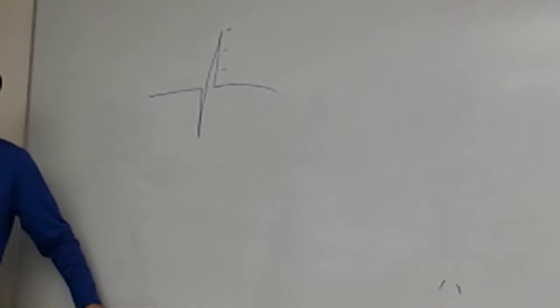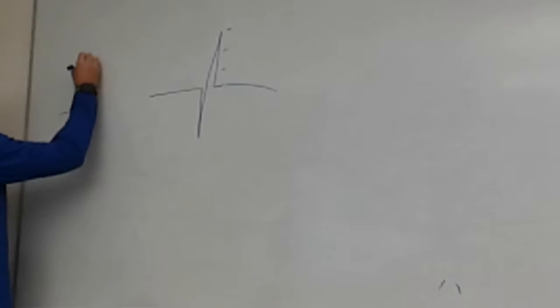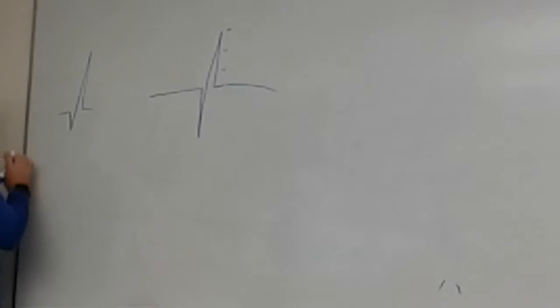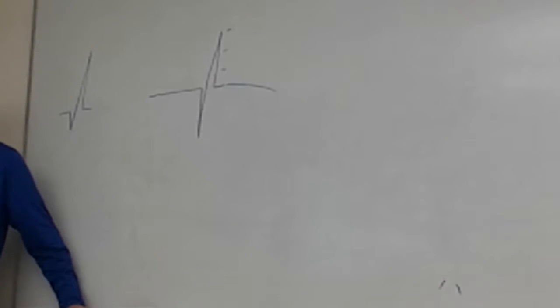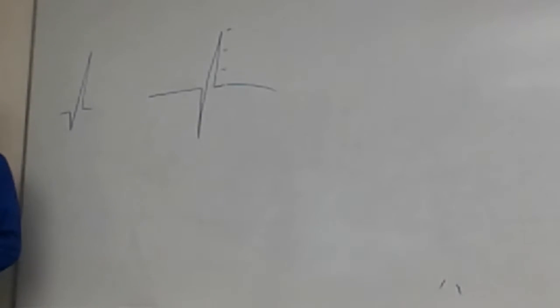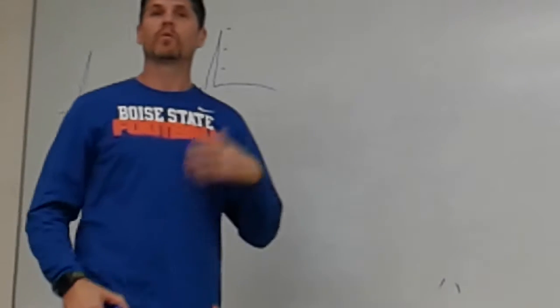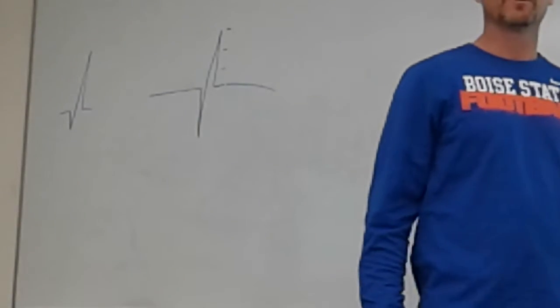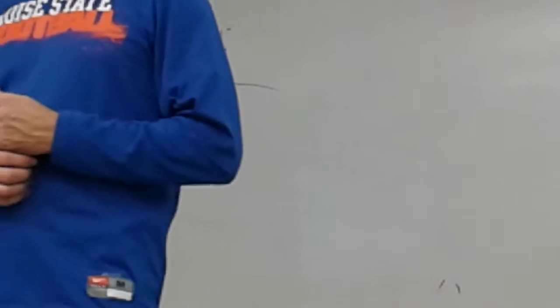In other words, if we have a Q wave, it should be small and should not take very much time. So if it is a wide Q or a deep Q, it's pathologic. It means something bad. Does that make sense? Any other situation, it's normal. In other situations, when you see a Q wave, if it's smaller than that and not wide, then it's just a normal function in that camera view.